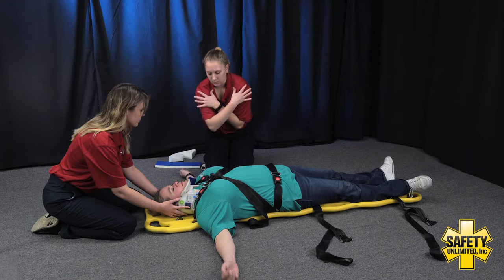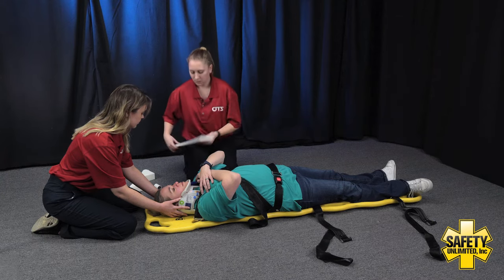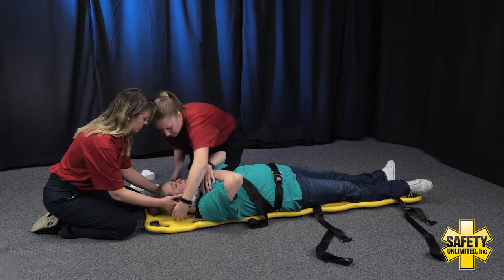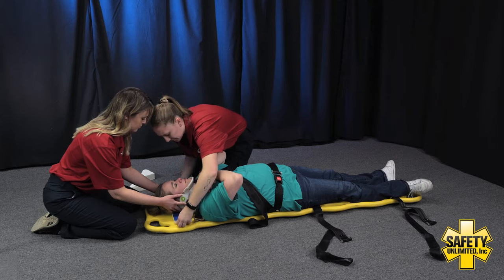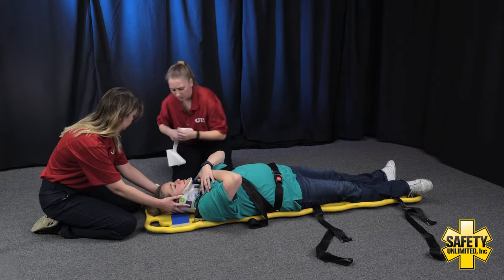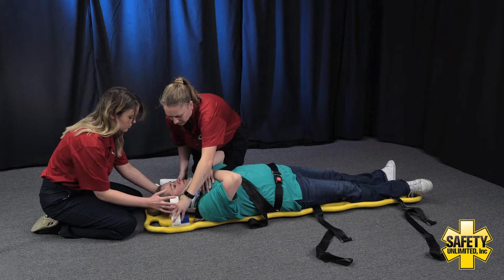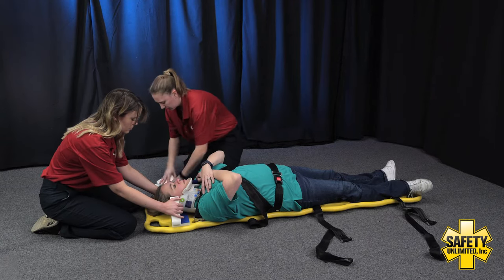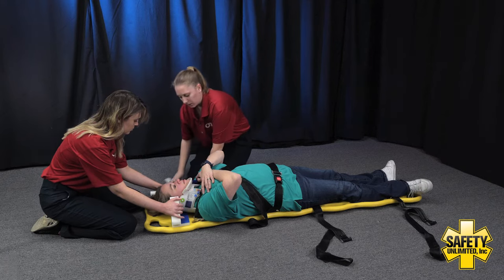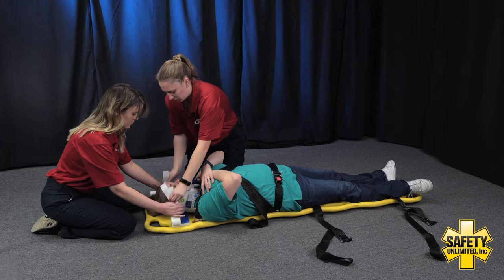Now we're going to go ahead and secure the head. If you can just go ahead and cross your arms across your chest for me, thank you. We're going to start with the head pad — I'm going to have my EMT assistant slightly lift the head, keeping in that neutral inline position, so we can get this pad underneath. Now we're going to get the head blocks into place. If my EMT assistant can go ahead and remove your right hand slightly, I'll place that block and hold it into place. We're going to do the same thing with your left hand — remove slightly, place the block, and hold it. Now we're going to take the forehead strap across the forehead.